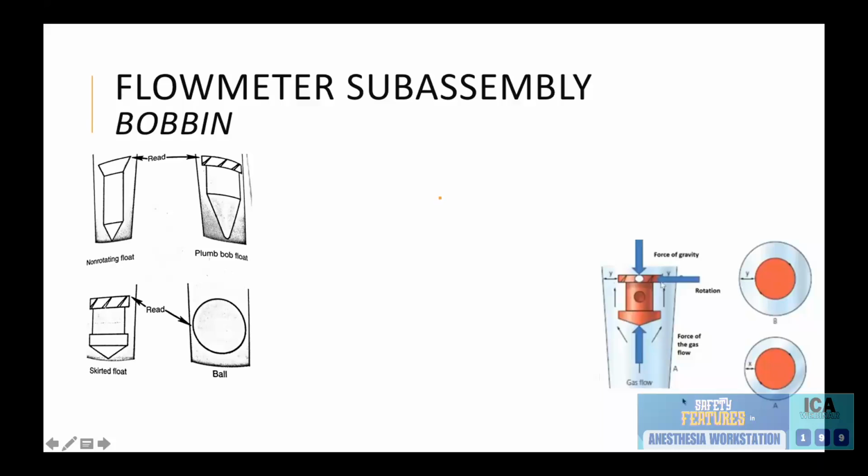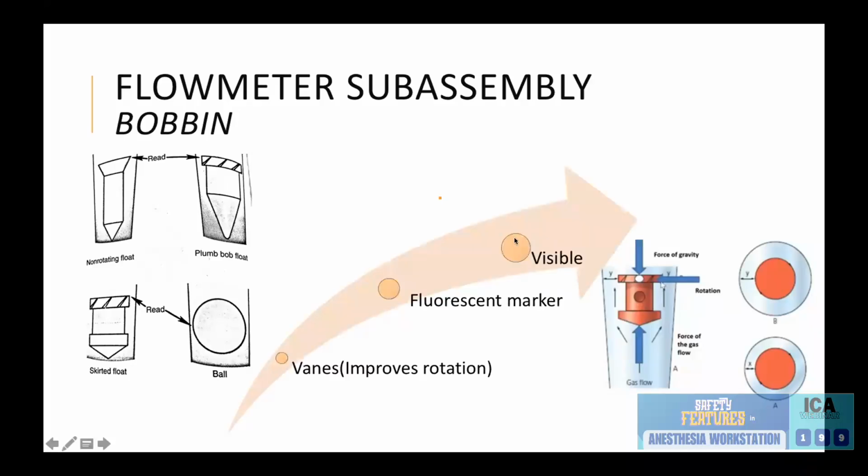In the lower part of the tube, when the gas flow is less, the flow is laminar. What governs the gas flow is Hagen-Poiseuille's law, which depends upon the viscosity of the gas. Higher up, more annular spaces are available because it is a higher flow. At that point of time, the flow may get turbulent. Once it gets turbulent, what determines the flow is Graham's law. So here, the flow will depend upon the density of the gas. A little physics. It is a very common question asked in exams, especially the viva.